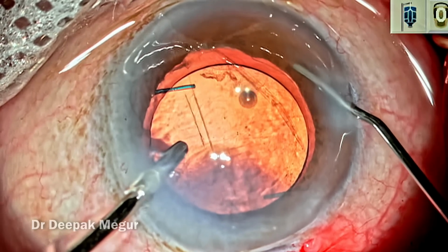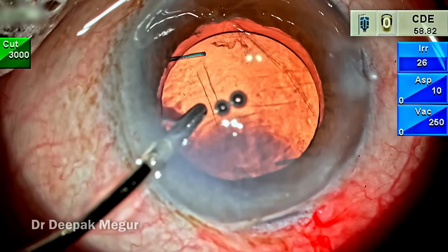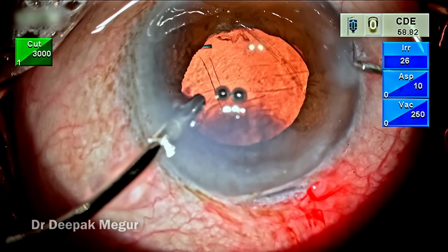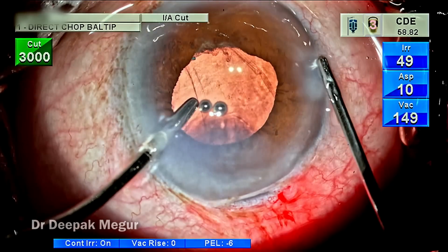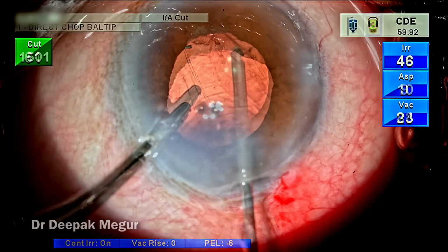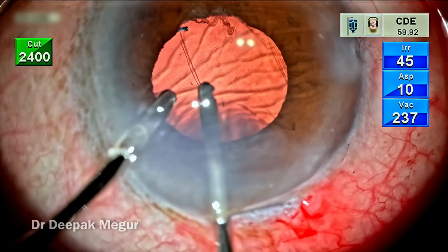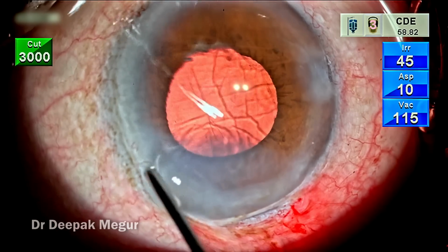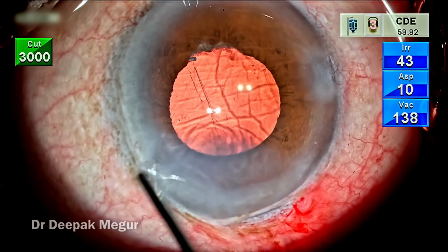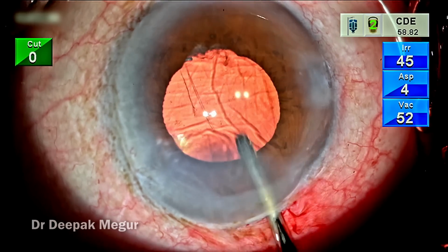Diluted pilocarpine is used to bring down the pupil. The irrigation is continuing with my left hand, and once the pupil comes down, again we get an idea where the vitreous is still sneaking out. I can see that a vitreous fibril is prolapsing through the right side port. Again, it's taken care of. So before closing, again ensure that the pupil is round and there's no vitreous fibril sneaking out through any of these incisions. I'm just nudging the lens to check for its stability.